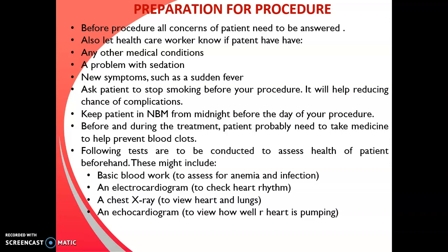Before the procedure, assess for any new symptoms, such as a sudden fever. Ask the patient to stop smoking before the procedure. It will help reduce the chance of complications. It is also very important to keep the patient NBM from midnight before the day of the procedure. Before and during the treatment, the patient probably needs to take medicine to help prevent blood clots. Basic blood tests, an electrocardiogram, a chest X-ray and an echocardiogram are to be conducted to assess the health of the patient beforehand.